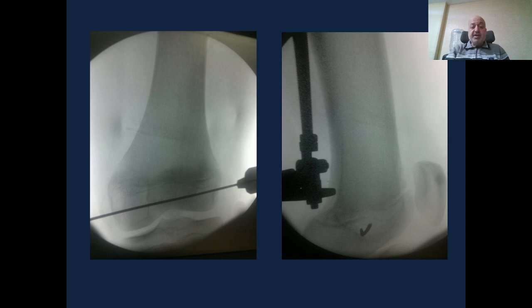Intraoperatively, we start by insertion of a reference wire, which is parallel to the joint orientation line of the femur. This wire should be located intraepiphyseal, just above the Blumensaat's line. We should never violate the Blumensaat's line, to avoid intra-articular insertion of the pins. This wire will be removed by the end of the procedure.